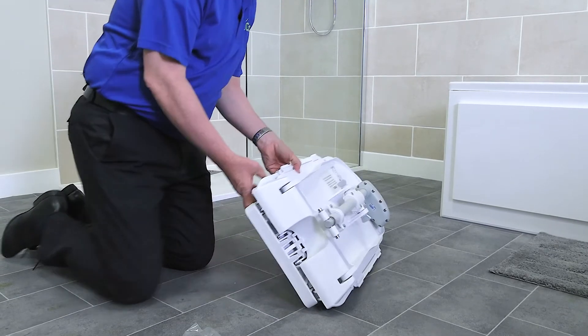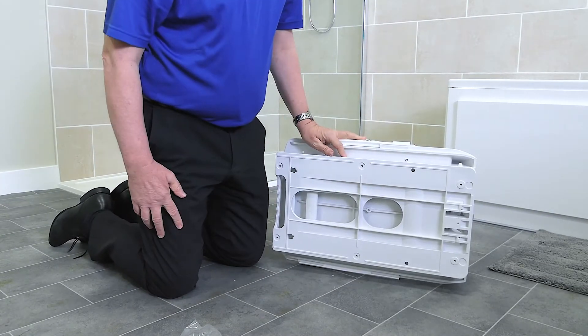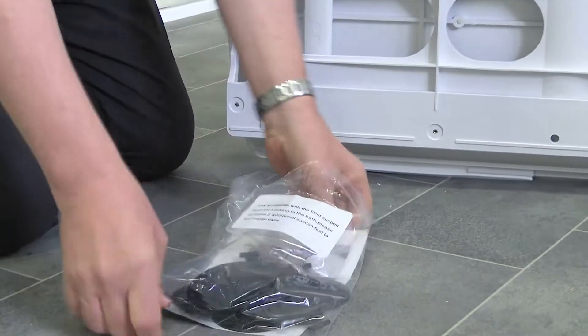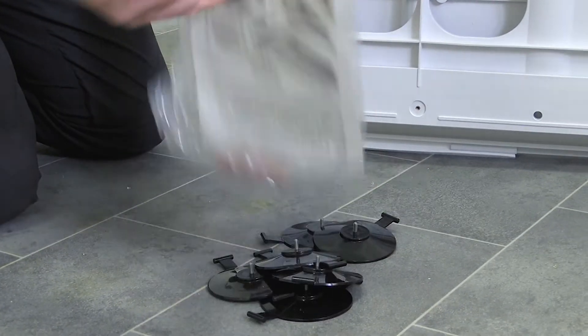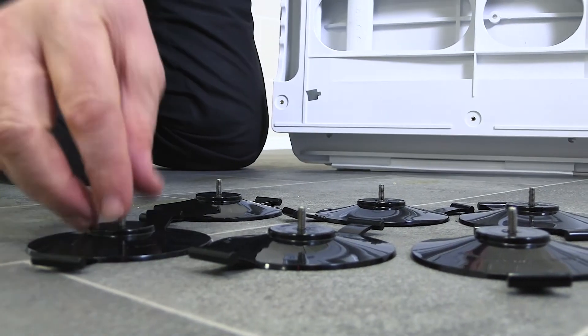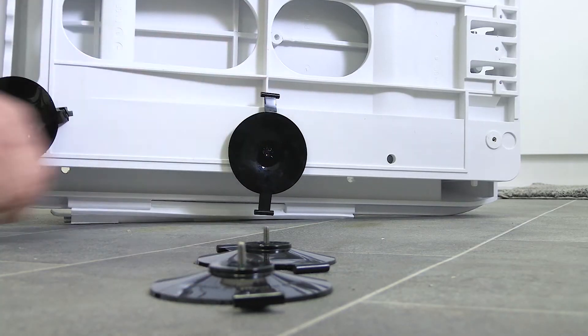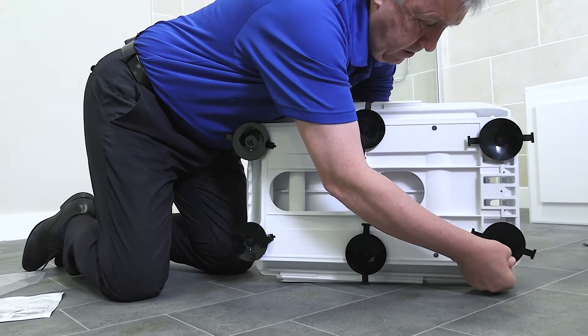Next, tilt the Bath Lift on its side. We recommend opening the backrest slightly so that it remains upright. Now add the suction cups to the underside of the Bath Lift. These will ensure the Bath Lift is fitted firmly to the bottom of your bathtub. Simply rotate them into the allotted holes on the underside of the lift and push the plastic tabs into the space next to the holes to secure them further. There are six suction cups in total. Please make sure they are rotated in fully to avoid the Bath Lift slipping whilst in the tub.